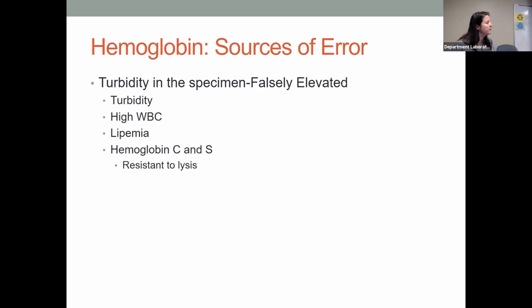All right, so remember your reference method for hemoglobin determination. Anybody remember what it's called? Cyanmethemoglobin. All right, that's a really good Board of Certification exam question. They probably won't ask too much detail about the chemical equation, but you do need to know that it's cyanmethemoglobin and that it is obtained by spectrophotometry. And then you'll need to know what can affect it, all these interfering factors like lipemia, increased white cell count, hemolysis.